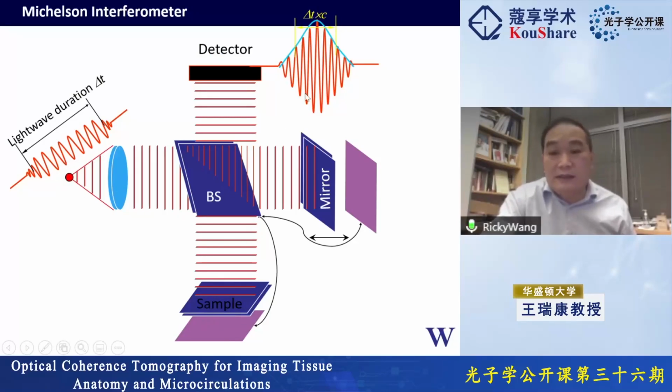And then you can see the signal mixing at your detector, right? Okay, so if this is no problem, I think that's really simple, high school physics, okay? And now because we are working with biomedical optics, we want to image biological tissue, okay?